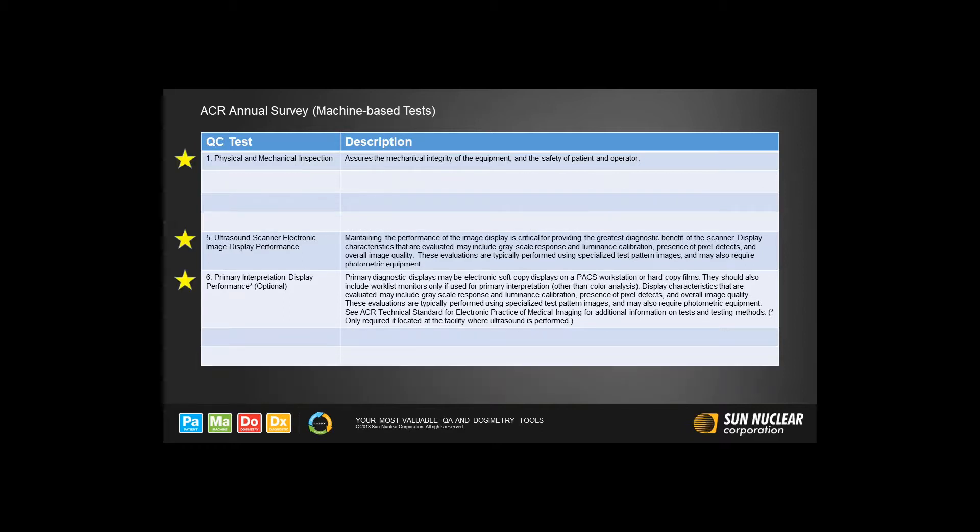Items on the ACR list include a physical and mechanical inspection of the scanner and, very importantly, making sure that the system display monitor shows all of the echo signal's grayscale values and matches the gray values on the PACS display used to interpret the images.